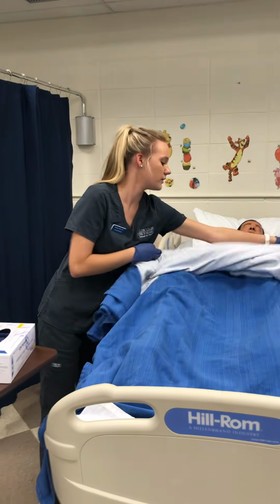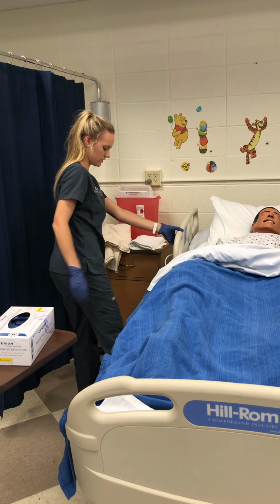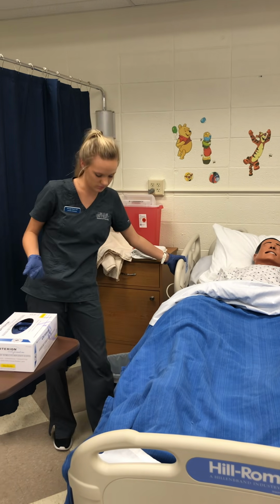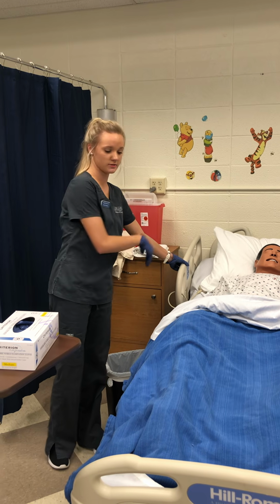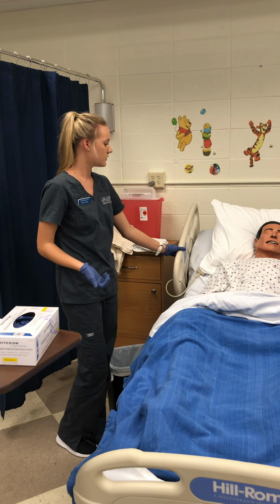And then I would put my patient back down to a low position. And then I would set him up a little bit, make sure he has his call light and everything. Mr. Jones, is there anything else you need from me?